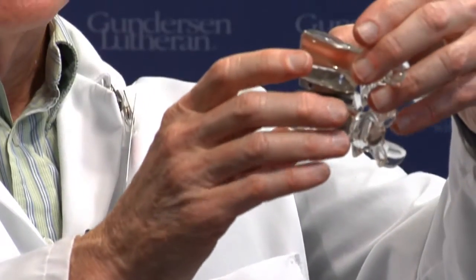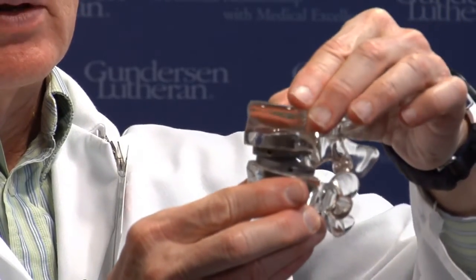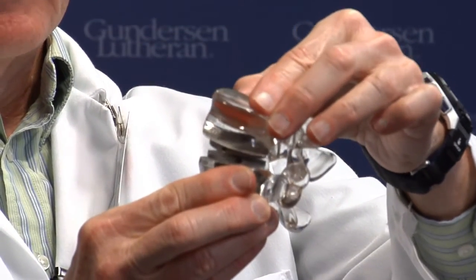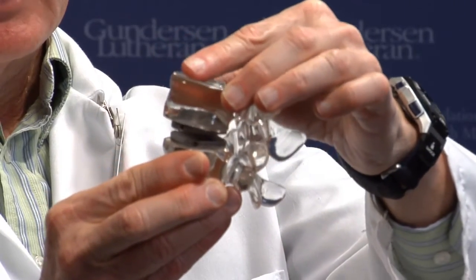The normal spinal disc is here, and then if it's removed, the arthroplasty device is implanted. You can see that it allows a fairly normal range of motion in both forward bending and backward bending.